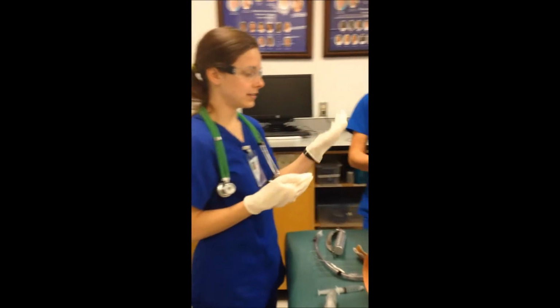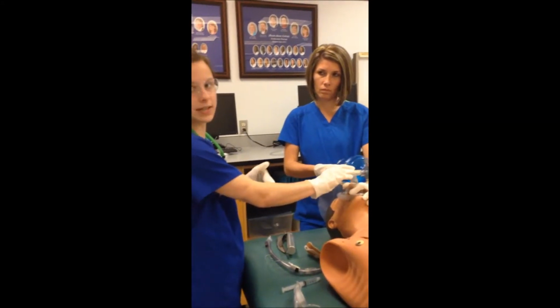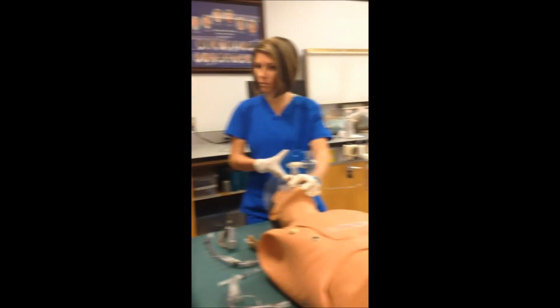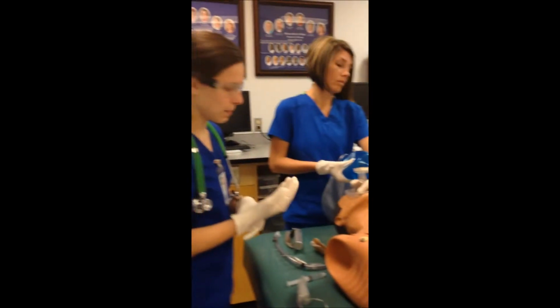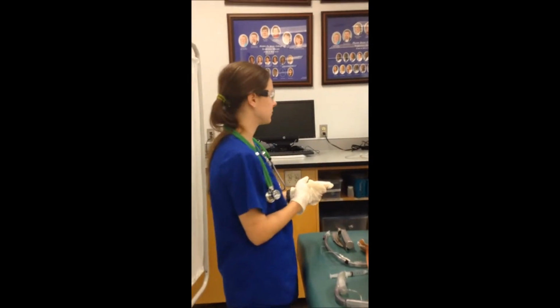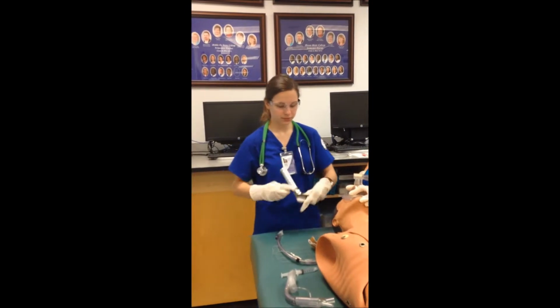I have an assistant ventilating my patient with an ambu bag and a CO2 detector. Also my stethoscope to auscultate placement. We also have suctioning equipment if needed. We're going to wait until the patient gets to 100% oxygen to get started. Okay, 100%? Okay. We're going to begin the procedure.